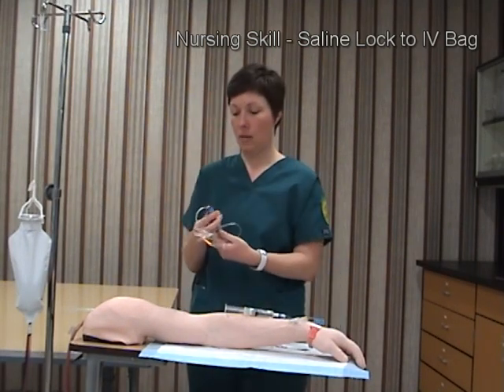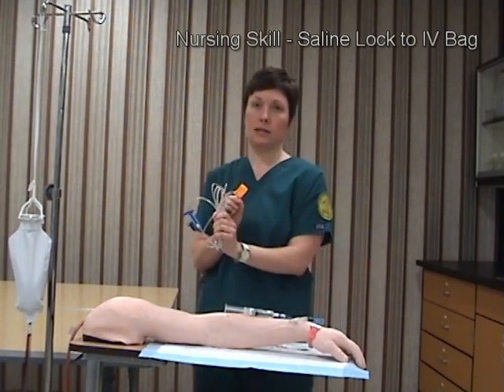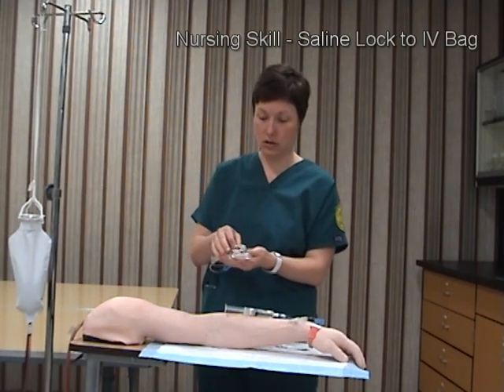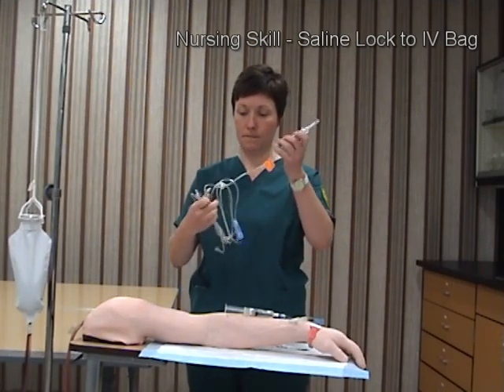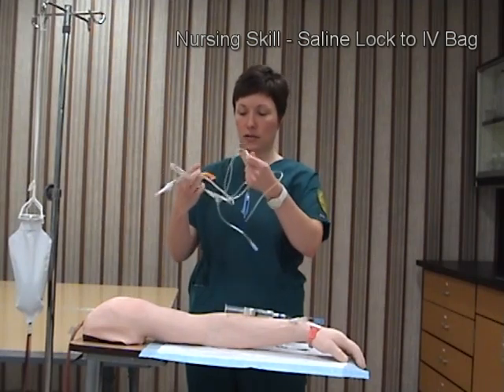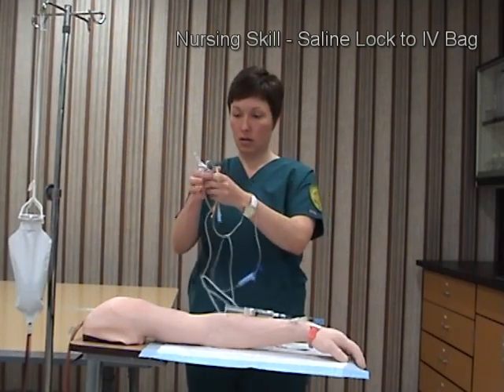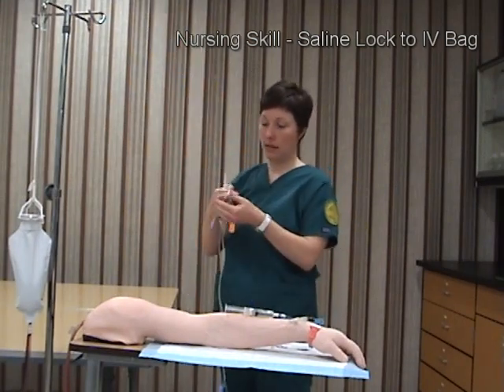I want to make sure I lock my roller clamp. I will also have completed a sticker with the time, date, and my initials to put on the tubing. This tubing needs to be changed every 72 hours in most cases, but you would follow agency protocol. It's important to remember that if the tubing were to touch the ground or anything of that nature, it would no longer be sterile and I would need to replace it.